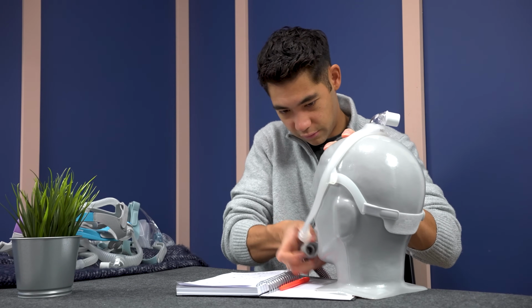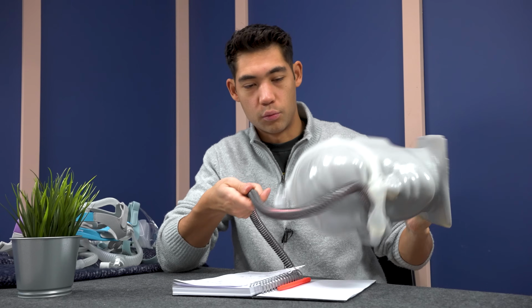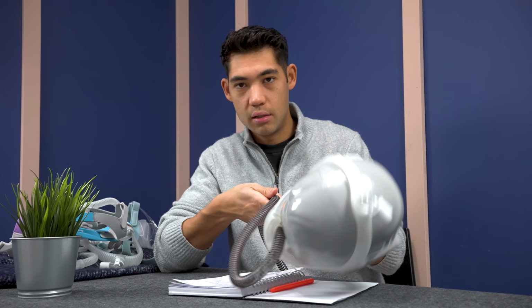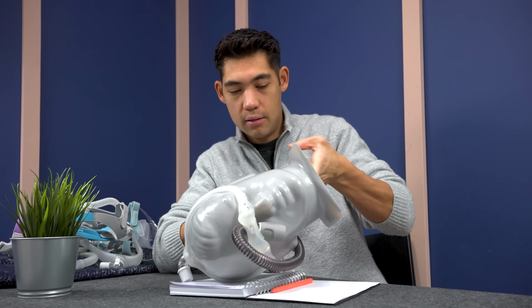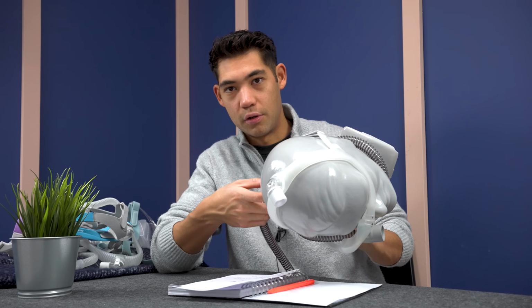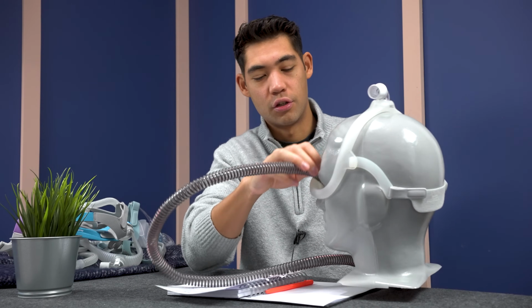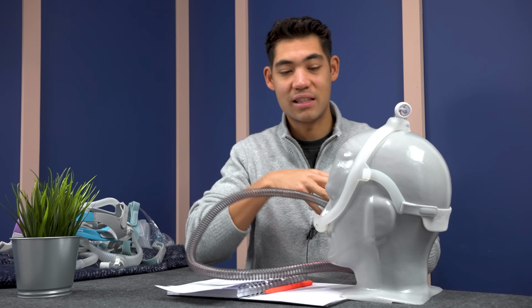Okay, pretend this is a front mounted mask, like this. So say this is like a front mounted mask, like a F30 for example, and we are rolling around. As you can see, the tube can start choking you up a little bit, see? Because it's not spinning on top of your head. So that is what happens when you have a front mounted mask, typically not as good for side sleeping. And that's about it. That's kind of what you need to consider when you are buying a CPAP mask for side sleeping. So now we're gonna talk about my favorite masks for side sleeping.